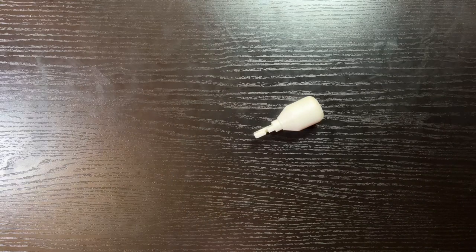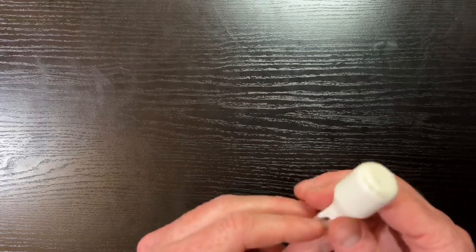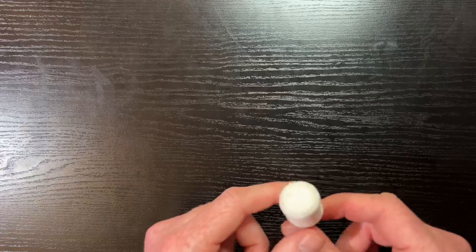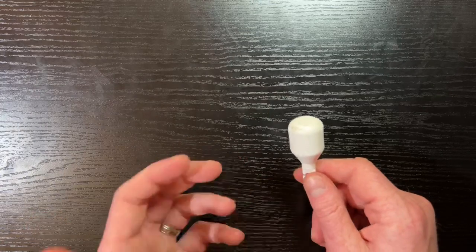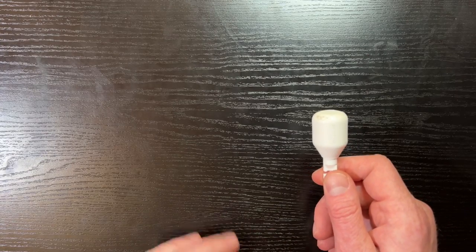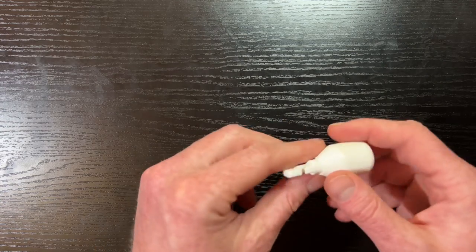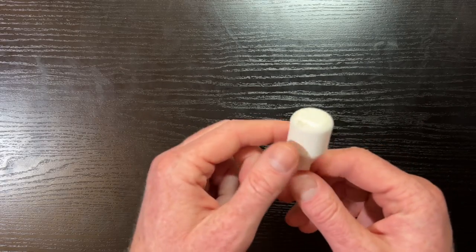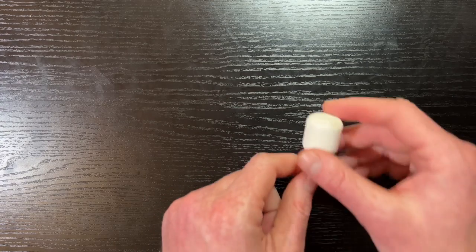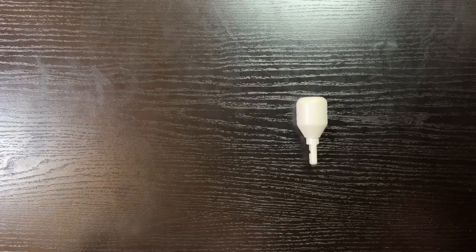The second cane tip is a marshmallow cane tip. On my black desk I have a white marshmallow cane tip — it's named pretty well, very much shaped like a marshmallow, white and curved. It's made out of nylon like the pencil tip, costs about $2.50, and is about 17 grams — a little heavier than the pencil tip but still on the lighter side. It has a little hook to attach to the cane, and it doesn't roll.